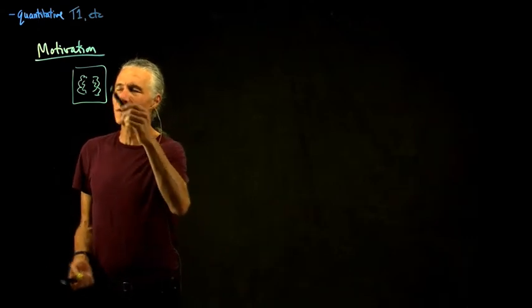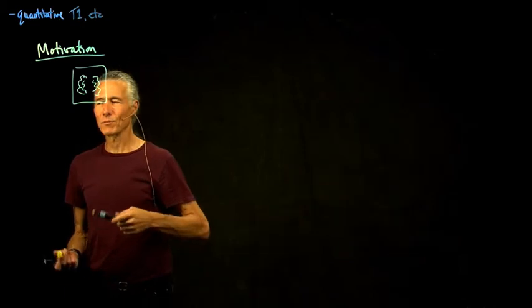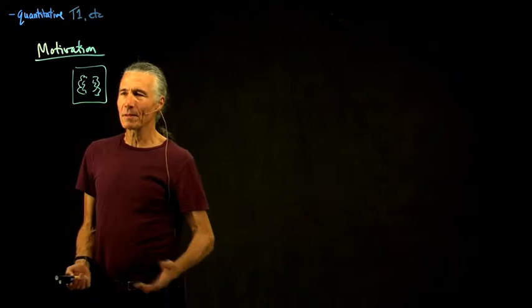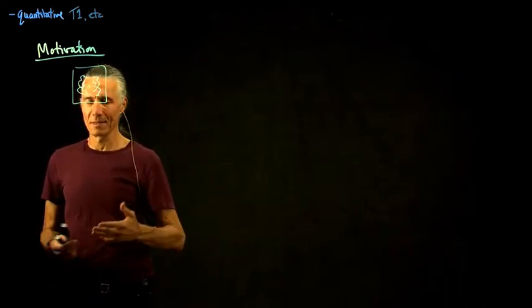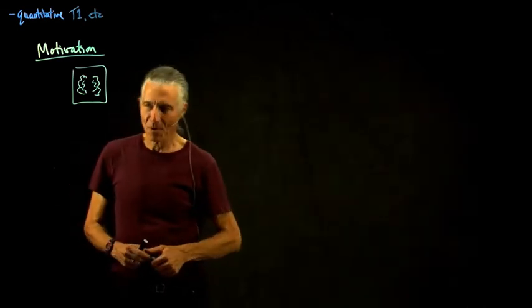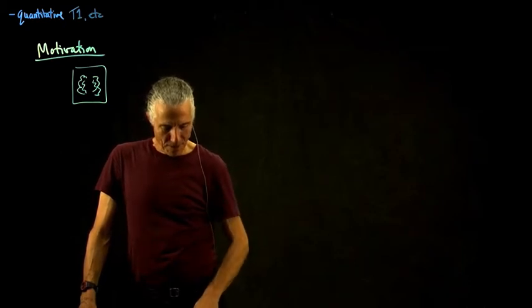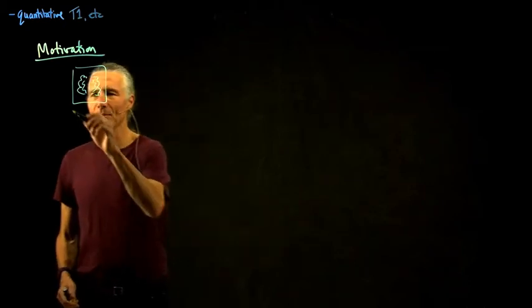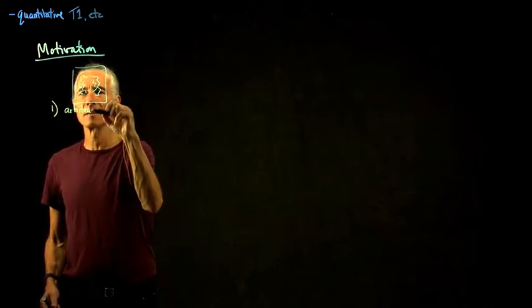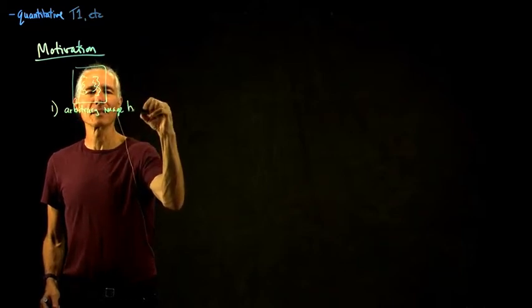On the Siemens scanner, the numbers might be integers that go from, say, 0 to 500, something like that. On another scanner, it might be numbers that go to 20,000. So those numbers don't have any specific meaning by themselves, and you can't compare them. So the first problem is you just have arbitrary values, image brightnesses.